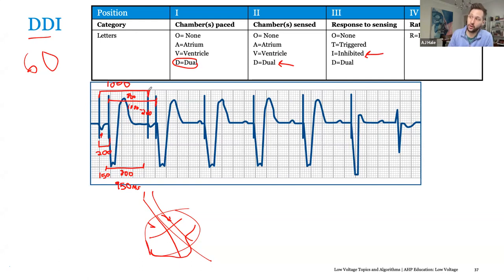So in this case, our timer starts in the atrium. It's once again based off the ventricle, but it starts in the atrium. An atrial event occurs, and then it waits its AV delay and paces the ventricle. Starts again, an atrial event occurs, so it doesn't pace the atrium. It waits its AV delay, or your V-based timing in this case, right? So it's still waiting 1,000 milliseconds. So you're starting to see this prolongation of your PR interval, and it gets worse and worse until eventually their intrinsic activity comes across.